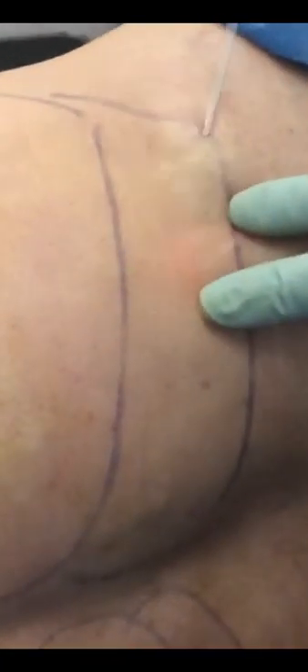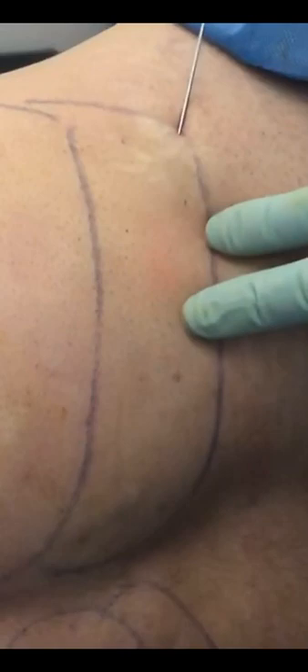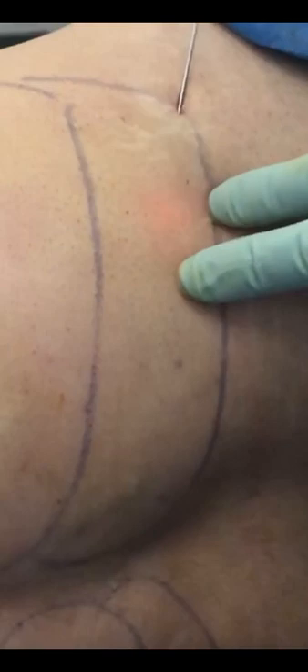We're doing a very small area. This patient really does have some scar tissue and excess skin, but I don't see any excess fat. We're doing laser-assisted lipolysis in the hope of tightening this excess skin. We've already done liposuction, and you can tell there's scar tissue from that. She looks great and wants to improve this area a little bit, but I don't think there is any excess fat in here.